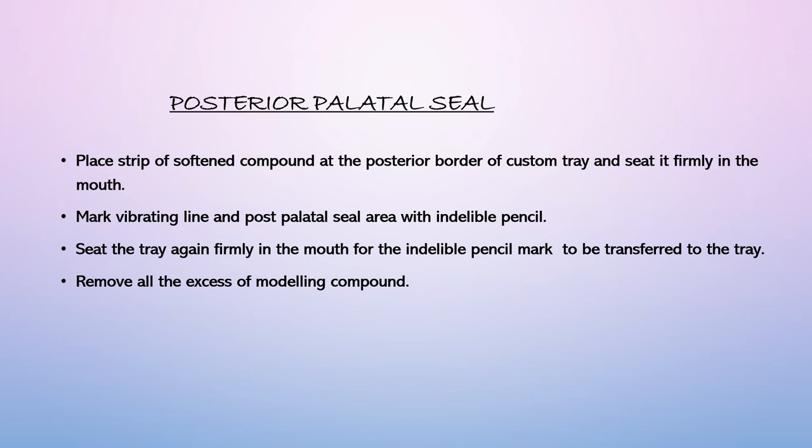For the posterior palatal seal, green stick compound is placed at the posteriormost border. An eosin pencil dipped in spirit is used to mark the PPS area after drying with a cotton swab. The patient is asked to say 'ah' vigorously, which reveals the junction of hard and soft palate — the anterior and posterior vibrating lines. This area is marked, the tray is seated, the patient again says 'ah,' and the marking transfers to the custom tray to reveal any overextensions, which are trimmed with a BP blade.